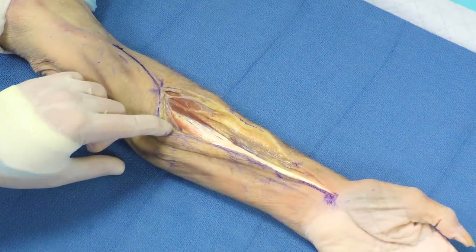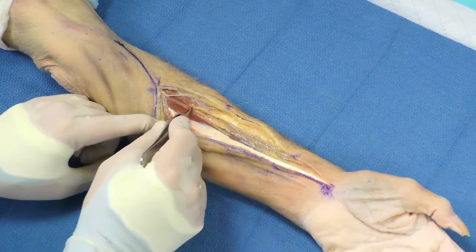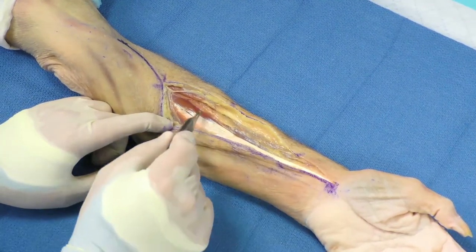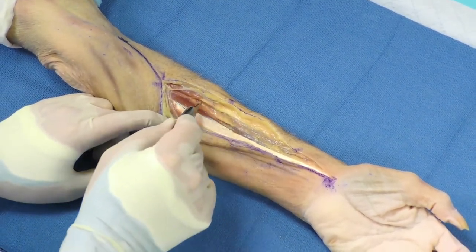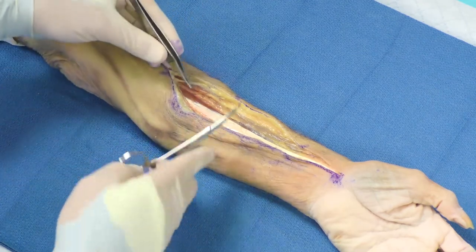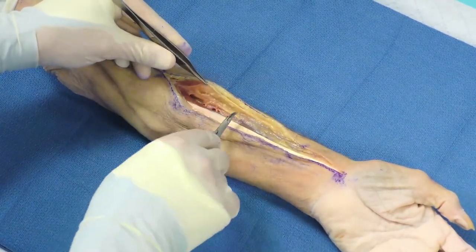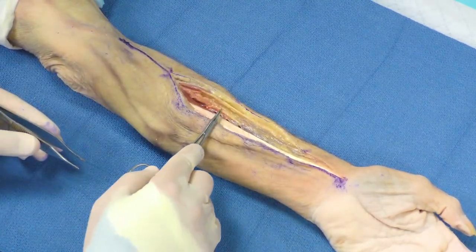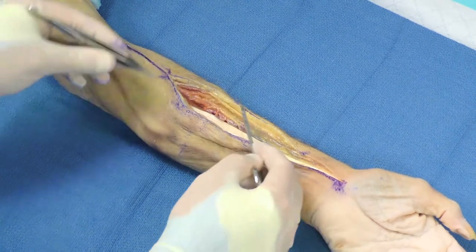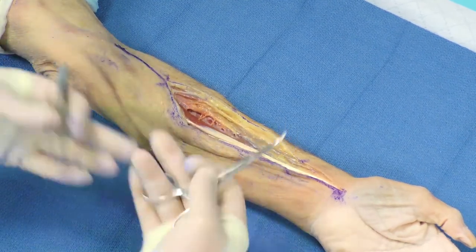Looking at the proximal aspect of the wound: this is brachioradialis and this is flexor carpi radialis, and the radial artery should be between the two. Neurovascular structures will be surrounded by perivascular or perineural fat, so when you see that stripe of fat, know that you're close to those structures — that's the time to dissect more carefully. Dissect parallel to structures at risk, spreading longitudinally to protect them. There are perforators from the radial artery to both the flexor carpi radialis and the brachioradialis that can be taken either way. Sometimes this dissection is done for you by the fracture itself.